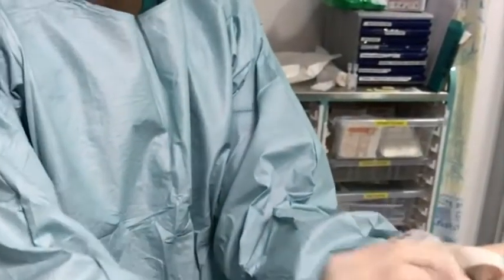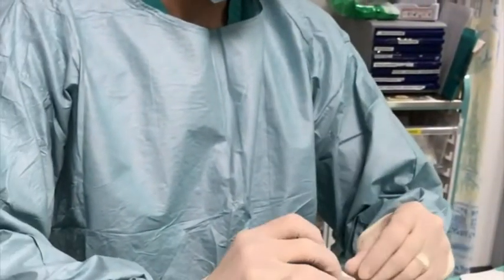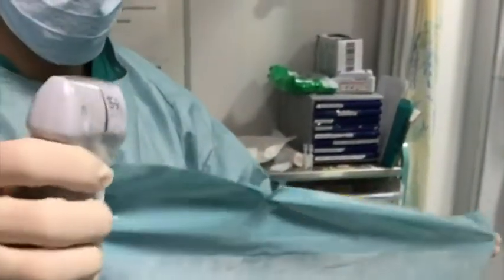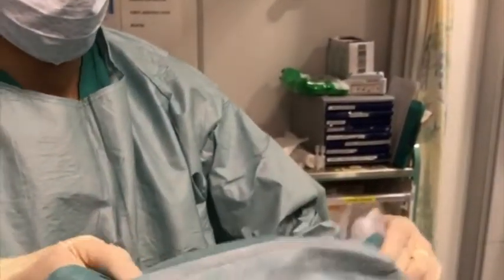You can choose to pick off all the backing paper off the tegaderm, but this is quite tricky to do and isn't necessary. Use one more sticky drape to cover the probe head. Take care when doing this so that the ultrasound probe cable does not desterilise your field.